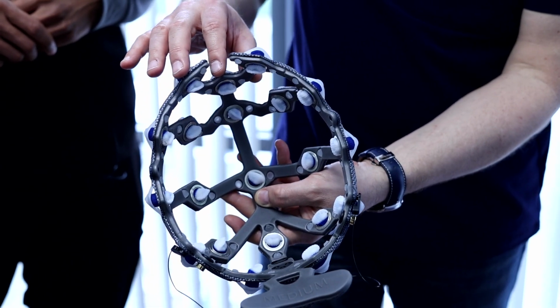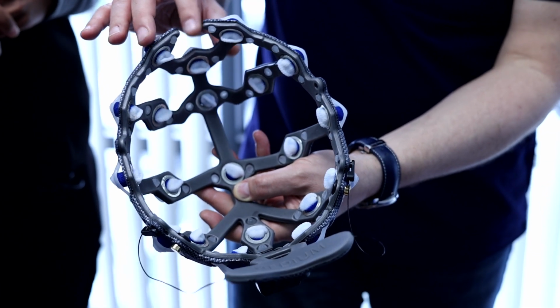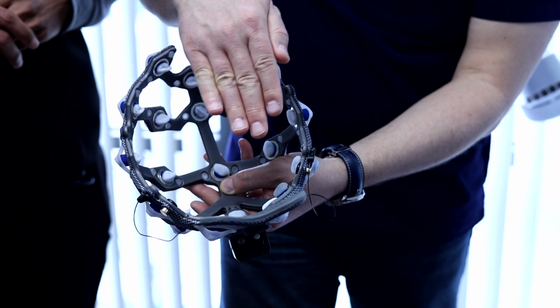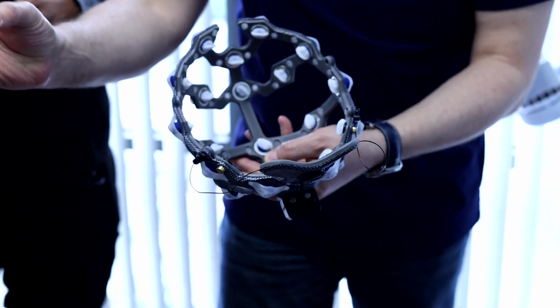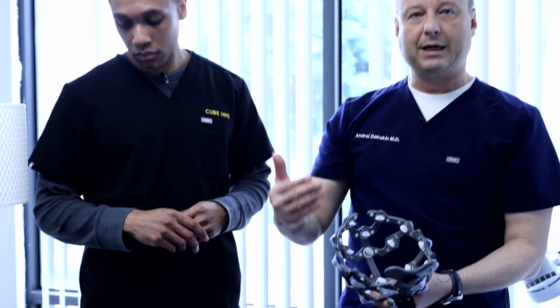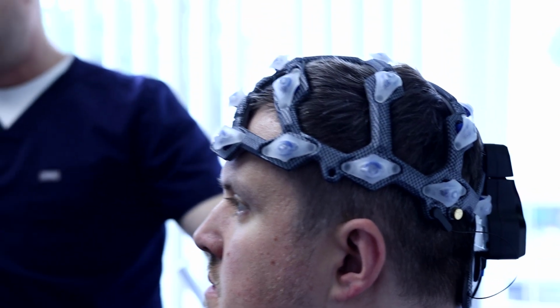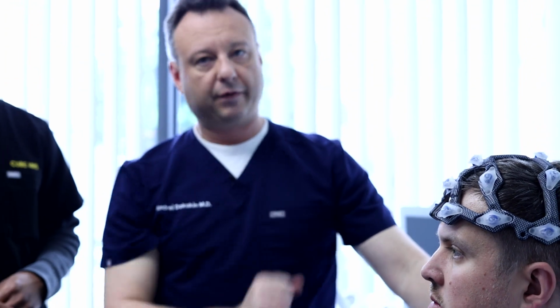So therefore we're going to be reading electrical activity of the brain from many regions of the brain, as you can see here. And we're going to summarize that data, and we are going to create a nice report with some explanations of any individual symptoms. And we're going to start recording those waveforms on this cup. We've been actually treating Dima for at least 10 sessions, yeah? I think 10 sessions. So this is a follow-up study.